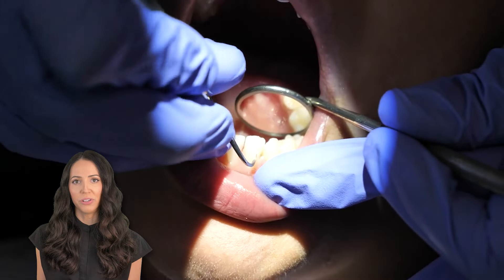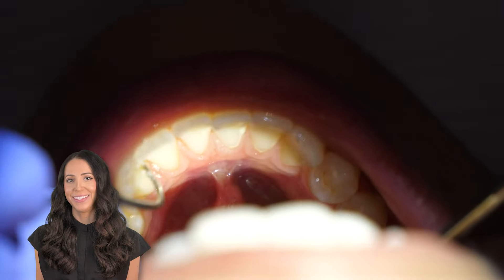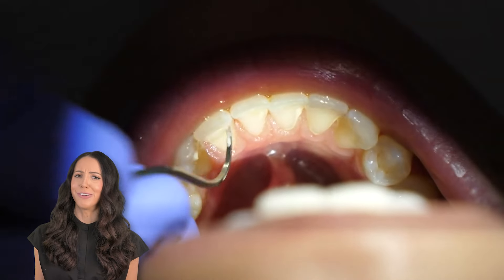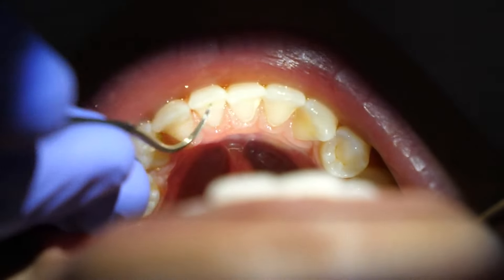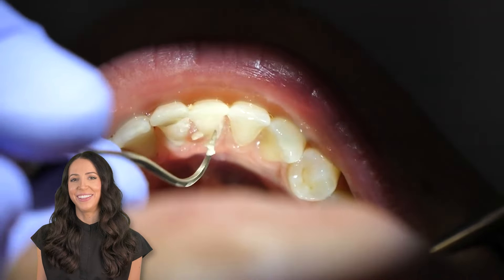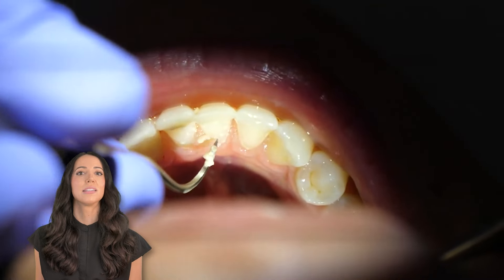I'm cleaning the direct facial, but I'm still focused on the surface away from me. Once I finish all these surfaces away from me, you'll see I go back and check all the direct facials and the direct linguals. When I am cleaning the interproximal surfaces, I always start the motion by wrapping around from the facial. I changed my instrumentation a little to get the facial because I felt something there.